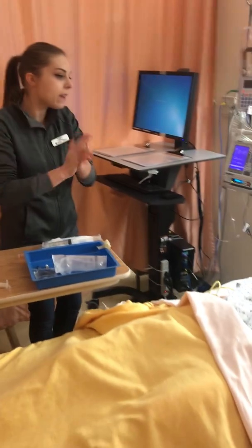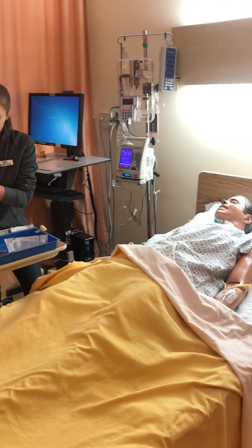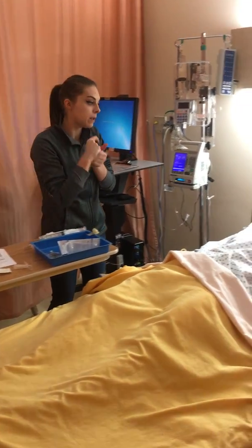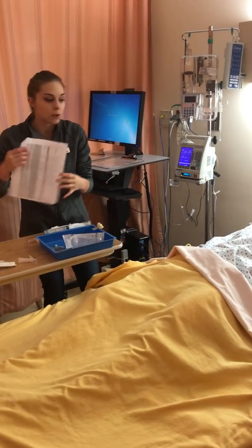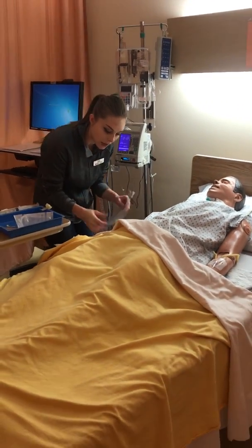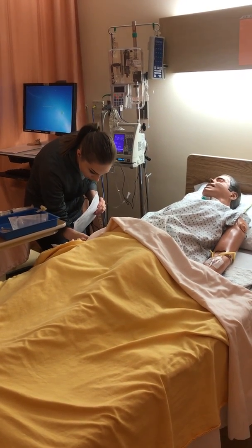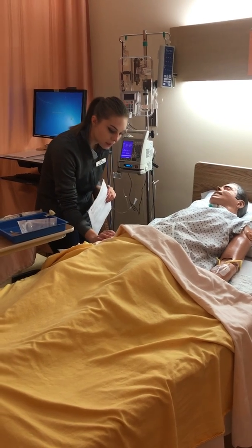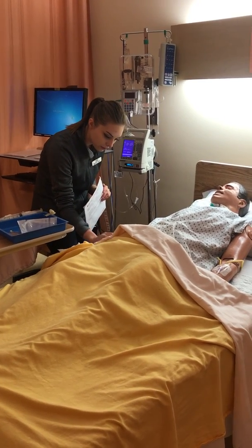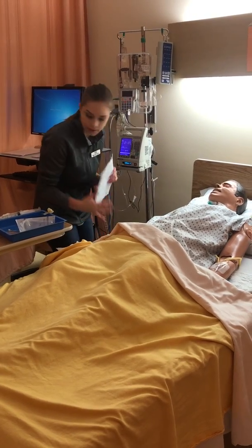Knock, knock. Hi there, I'm Kara. I am your student nurse today. I'm going to be administering your medication. So I'm just going to get you to tell me your name and your date of birth just so I can check. Okay, and you have no allergies either. Good. I'm also inspecting his IV line at this time, just to make sure that it's still intact, there's no redness, he's not experiencing any pain.